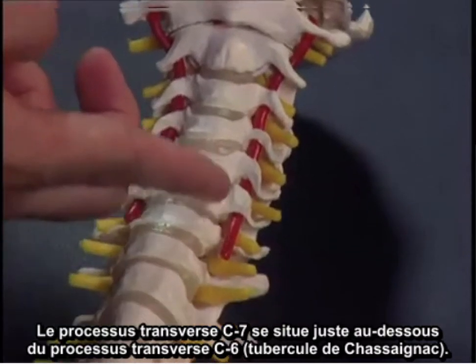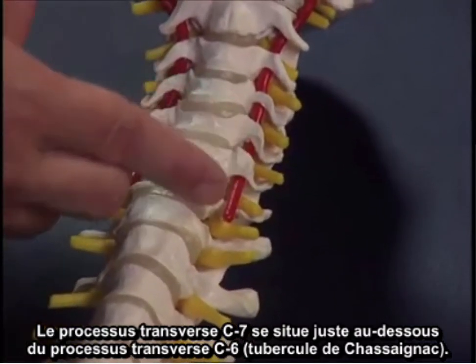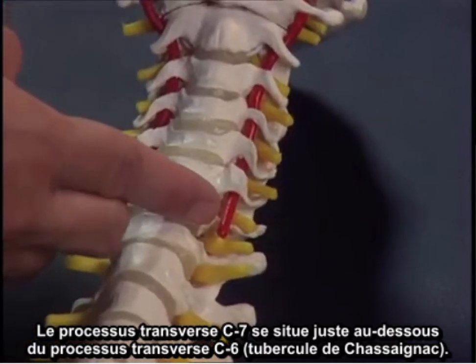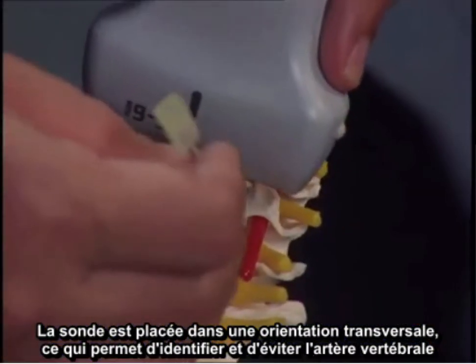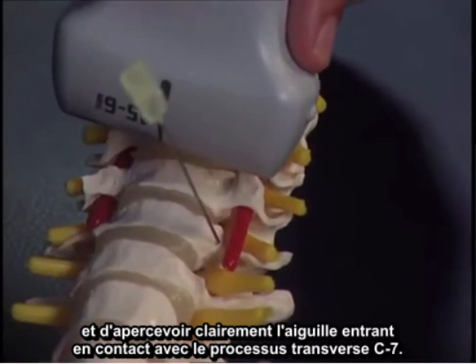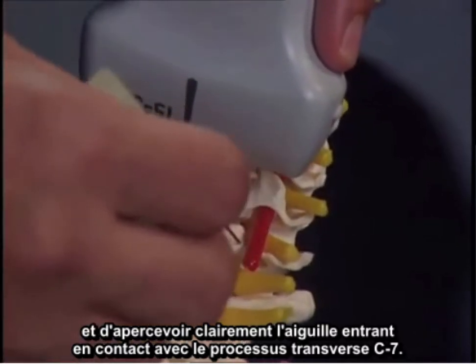The C6 transverse process, Chasniak's tubercle, and immediately inferior is the C7 body and transverse process. The probe is placed in the transverse orientation, clearly identifying and avoiding the vertebral artery, and the needle coming in contact with the C7 transverse process.